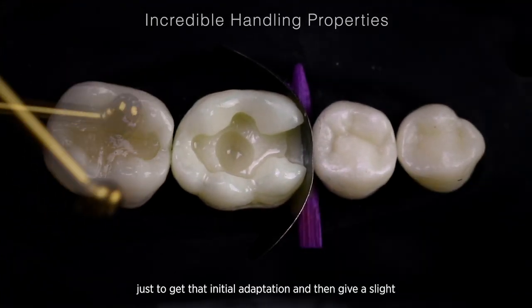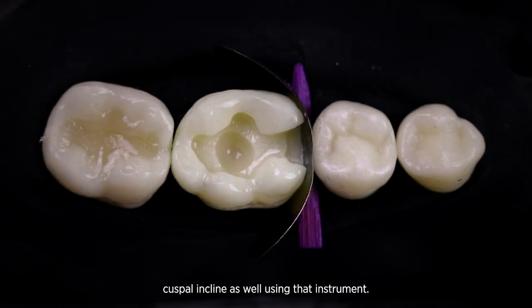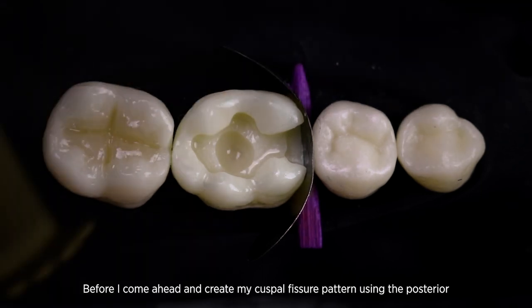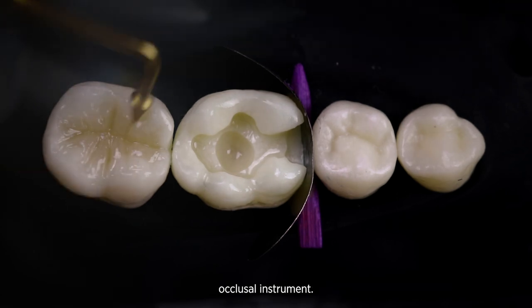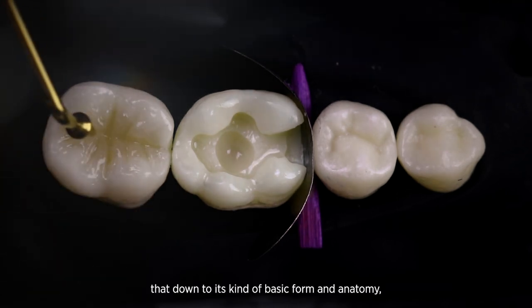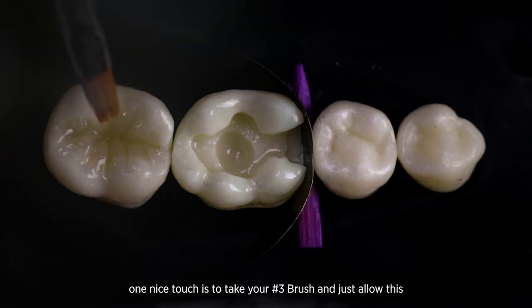I'll get that slight cuspal incline using that instrument before I come ahead and create my cusp and fissure pattern using the posterior occlusal instrument. Once I've got that down to its basic forms and anatomy, one nice touch is to take your number three brush and just allow this to get that perfect adaptation up onto the natural tooth structure.